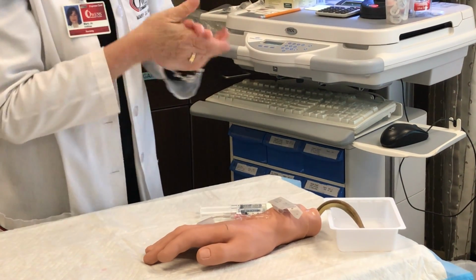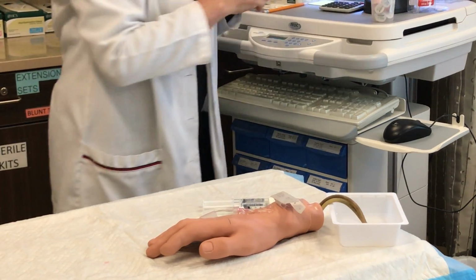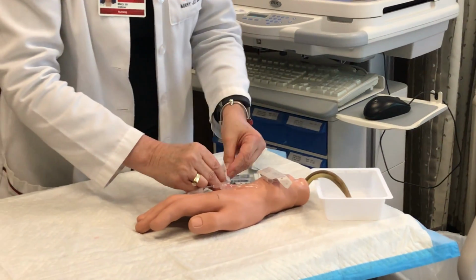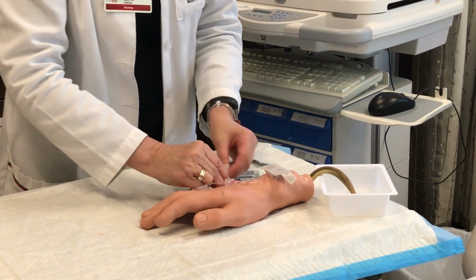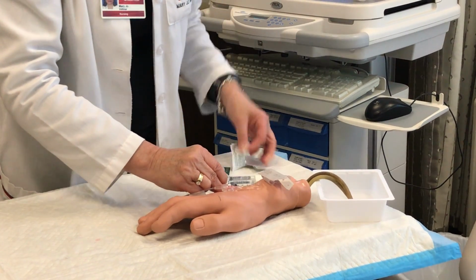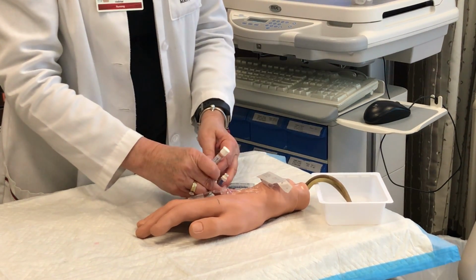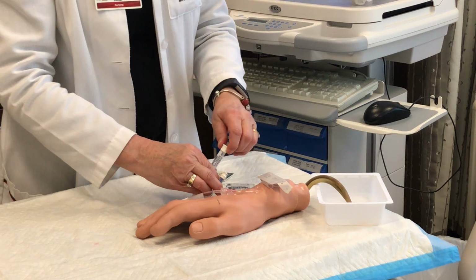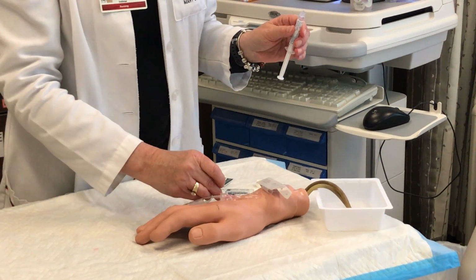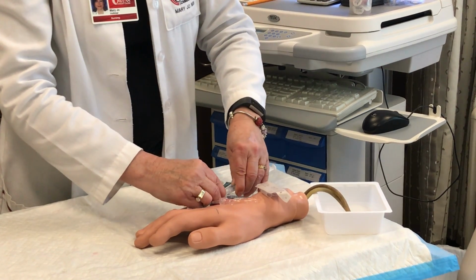Cleanse INT port per agency policy, or remove swab cap. If there was a swab cap, I would remove that, but on this one there currently isn't, so I'm going to cleanse for 15 to 30 seconds and get the grooves on the side and the tip. Break seal on first normal saline flush syringe and purge air from syringe. This can be done previously as I did with my checks, or you can do it now, but it definitely needs to be done before you connect this to your IV.